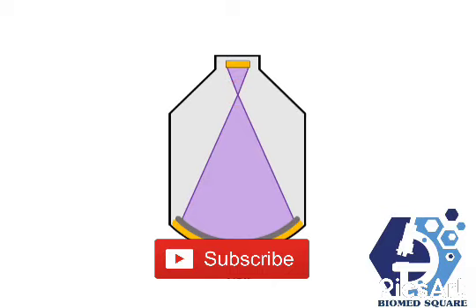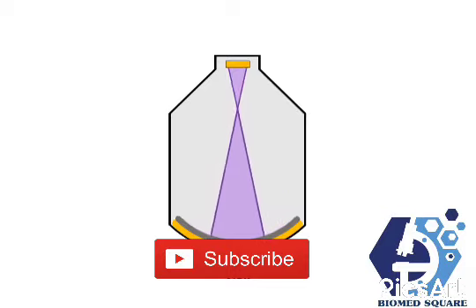When we go from a 25 centimeter to a 17 centimeter, we increase the voltage across the intensifier. Increasing voltage reduces the field of view and magnifies the image. However, a magnified image will be a dimmer image, so we need to increase the MA to compensate. The patient will receive over 2 times the dose when the image is in magnification mode.